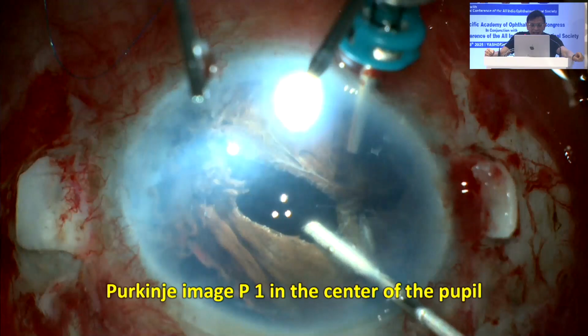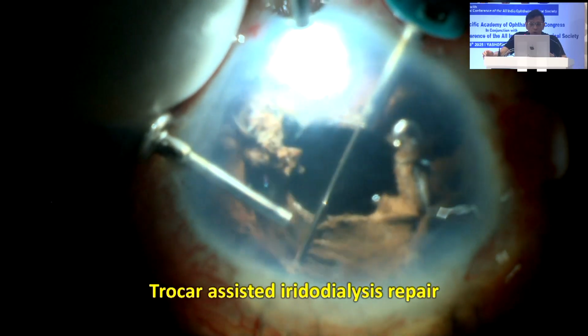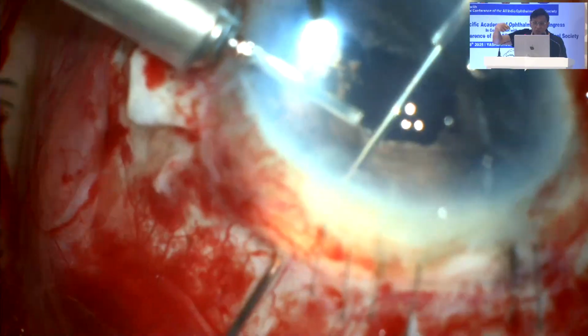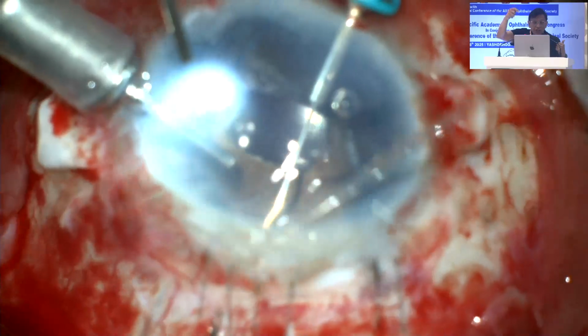But look, there's an iridodialysis also on the top, if you see. Okay, so now I'm wondering, the technique which we tend to use is the trocar assisted iridodialysis repair. Wherever the dialysis is, right opposite I fix a trocar. Now take a double arm Prolene needle. Okay, pass it through the iris, bring out through the sclera. Now this is a double arm.